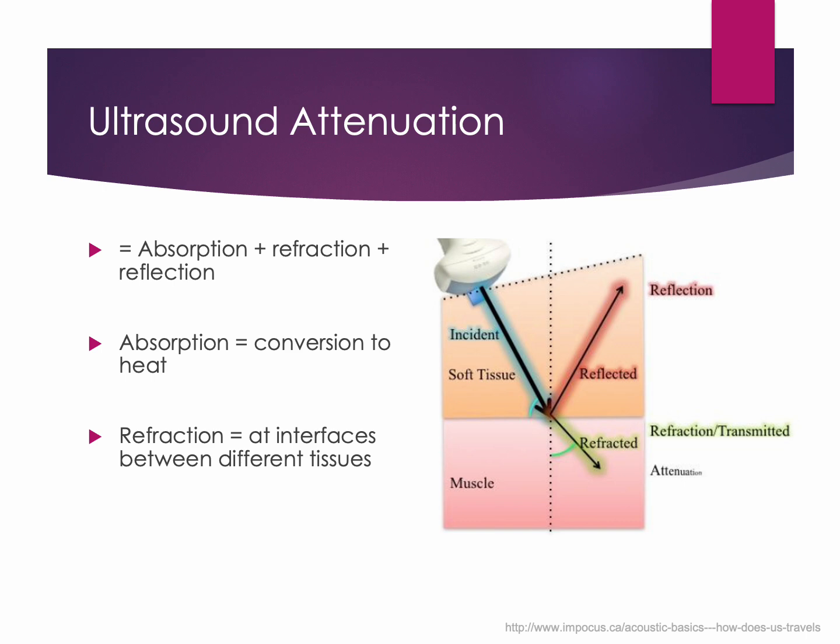Refraction occurs when the ultrasound wave bends and is redirected as it passes between tissues with different densities. This means that less energy reaches the intended target tissue, and the energy becomes more dispersed. So when we put this all together, absorption is what creates heat, and refraction can redirect energy away from where we want it. Ultimately, when you're using ultrasound, you're not just applying heat, you're carefully managing how energy is delivered, absorbed, and distributed within the body.